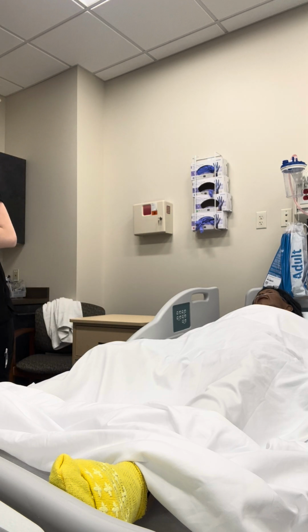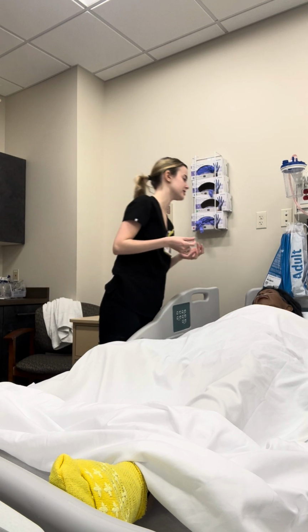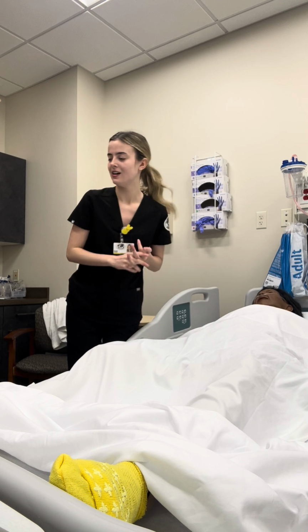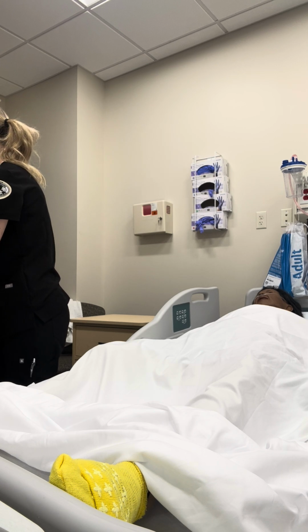Then I would clean my supplies. I'm going to keep a syringe. And I would perform hand hygiene, and then I would make sure side rails are up, bed is lowered, call light is in their hand, we're going to say. And then now we are going to simulate discontinuing the urinary catheter.